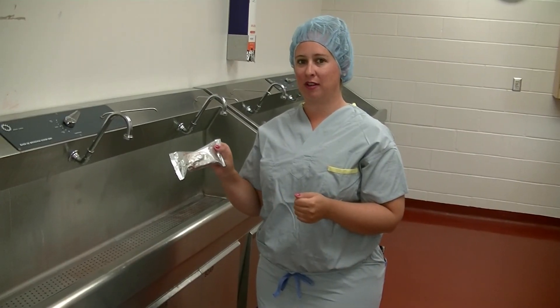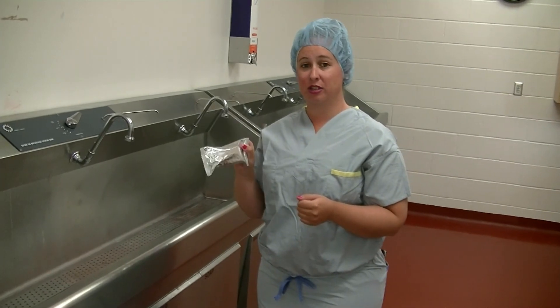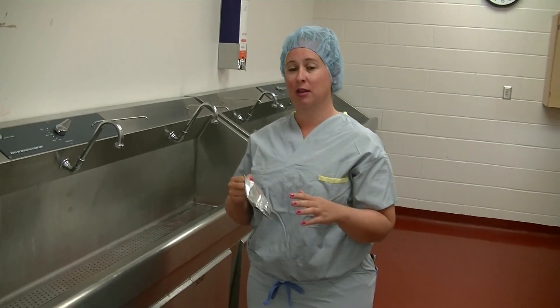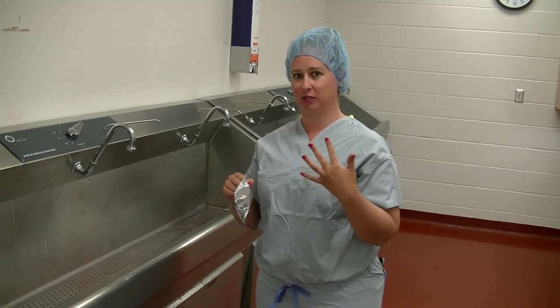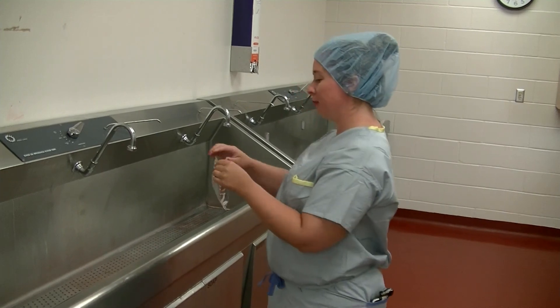Now we're going to do our five-minute scrub. This demonstration won't be the full length of a five-minute scrub, but I'll go through all of the steps so you know what a full five-minute scrub looks like when you come to junior surgery. Again, nail polish must be off — for the sake of this video, ignore my pink fingernails. Open up your scrub brush.